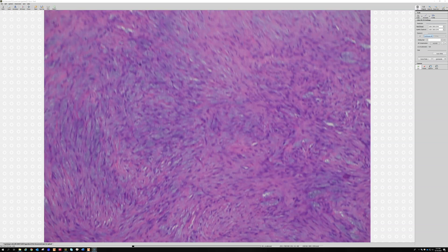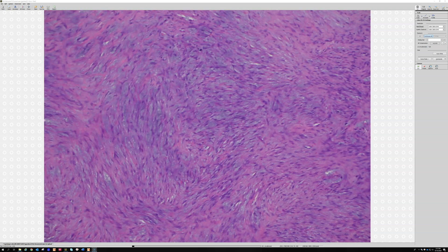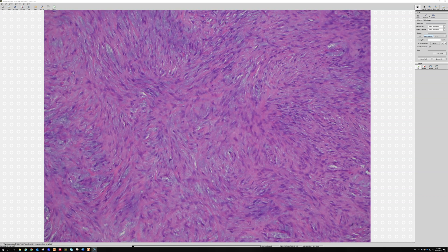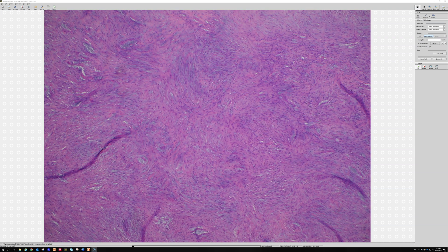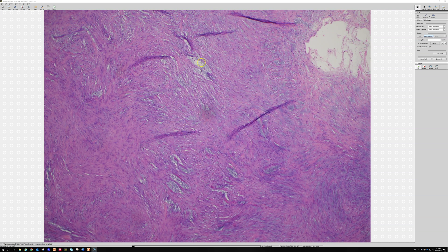The classic areas are these feathery tissue-culture-like zones made of plump spindle and stellate myofibroblasts with a background of loose myxoid change and a little collagen. This is what people describe as 'tissue culture' - it looks similar to fibroblasts grown in a cell culture dish. If you haven't worked in a lab, it may be easier to think of it as loose and feathery. One of the most helpful features is the presence of cystic myxoid microcysts - cystic degeneration with myxoid change.